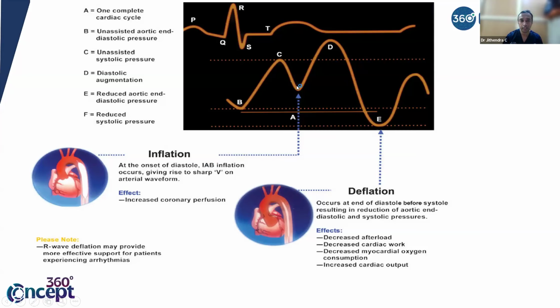Whereas with respect to your ECG, it will coincide with the T wave, at the middle of your T wave. So that is when your inflation happens. We'll read what the physiology is in the subsequent slides. This is just to show you the location of the inflation with respect to your ECG trace. Inflation happens at your T wave and deflation happens just before your R wave.